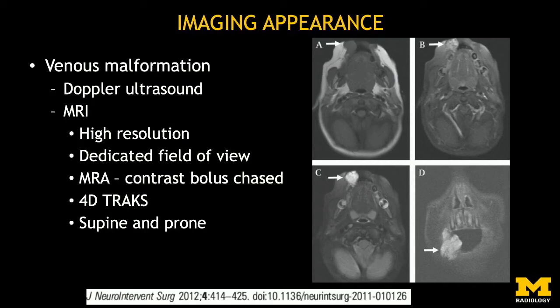This is a venous malformation in the angle of the mouth. They tell you the nerves and other important structures that are close to these lesions. When we are treating them with percutaneous sclerosant agents, they can injure these adjacent neural structures. So that is why it is important to map out the extent of these lesions with MRI.